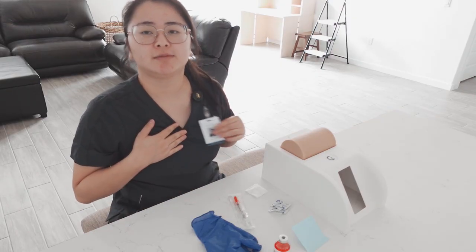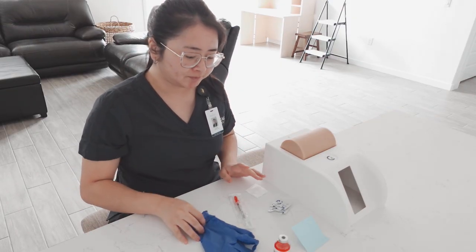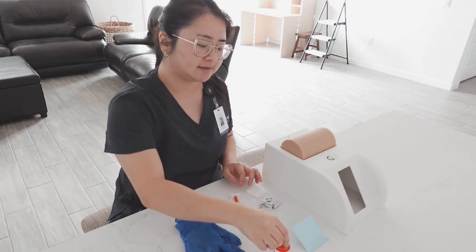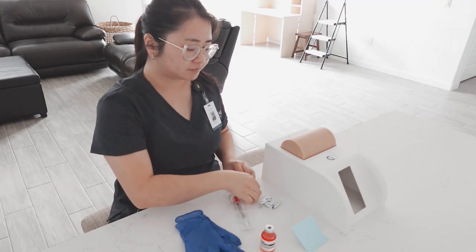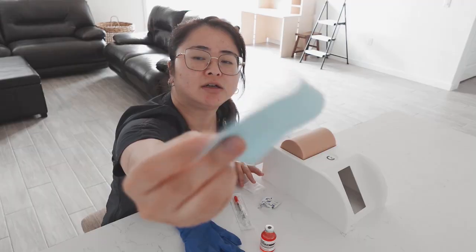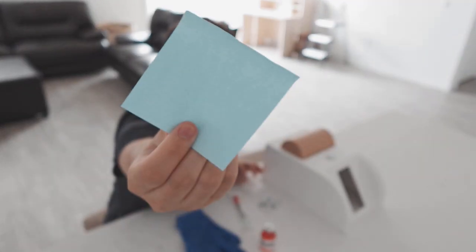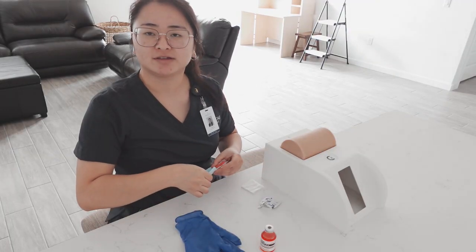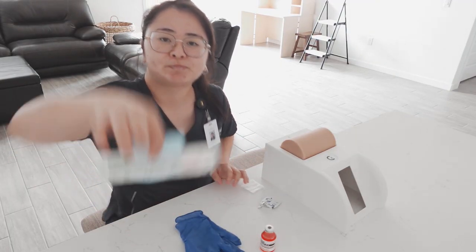I'm wearing my uniform, I have my badge, I have all my supplies. My supplies consist of a pair of clean gloves, 2 alcohol pads, my vial, gauze. I have this post-it note. There's nothing on it, that's just all I'm showing you. It's just a regular blank post-it note. It's just to show my supplies, so my camera will focus on my supplies when I show it to you.